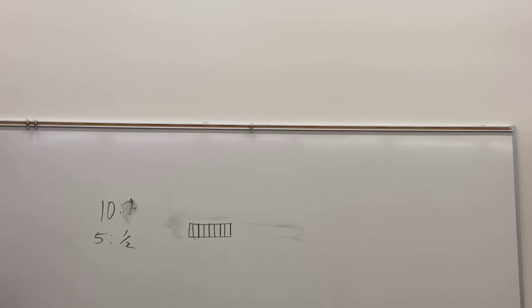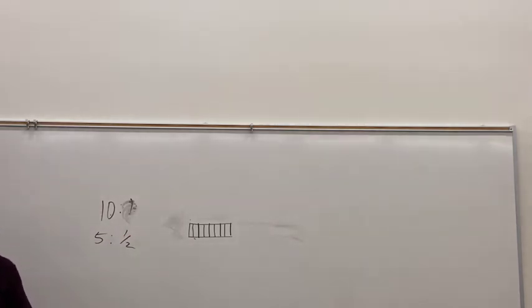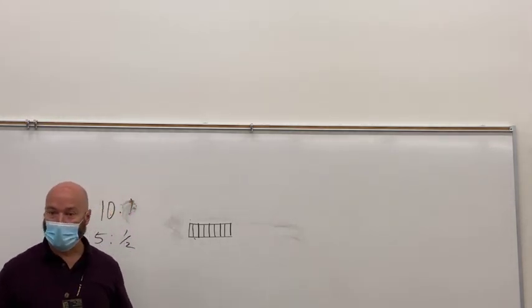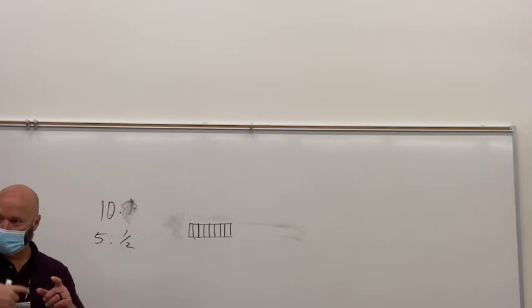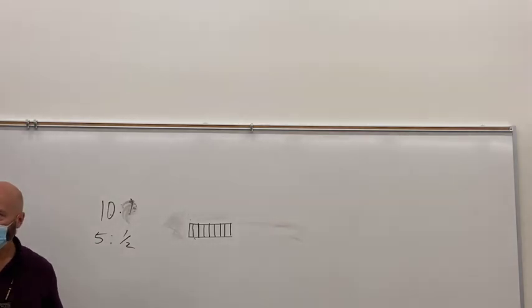That's really where you should be putting it. But back when I was in school, we had these great big fat grids, and the distance between the tabletop and the image receptor was greater than it is now. You're probably seeing some people putting their marker on top of the table or on the patient themselves. Anybody seeing that? Yeah. The reason for that is that back in the day, we would take the marker, reverse the tape, and wrap it around to make it nice and big and fat. And it would fit on the film and into the bucky quite nicely.